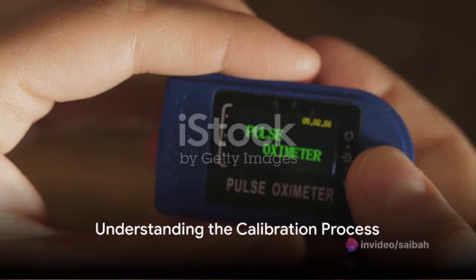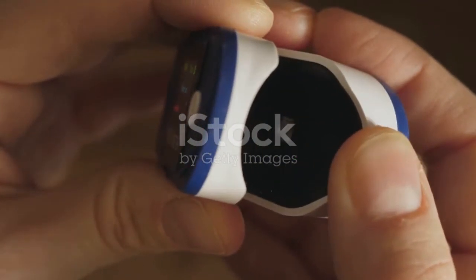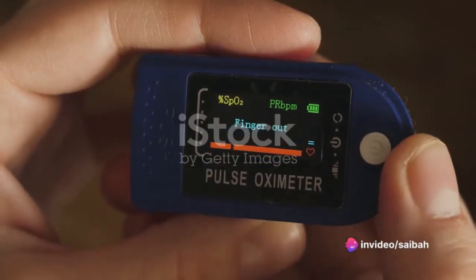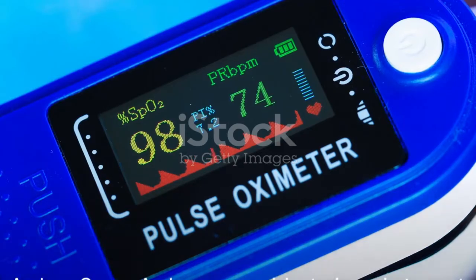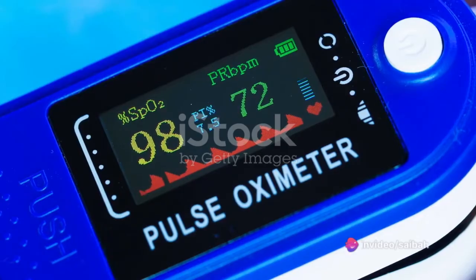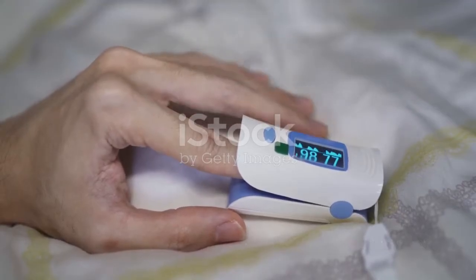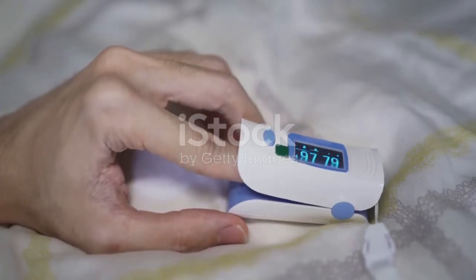Calibration is a critical process that ensures the accuracy of an oxygen analyzer. In the simplest terms, calibration is the process of setting or correcting a measuring device — in this case, an oxygen analyzer. Your oxygen analyzer is like a talented musician: it can hit all the right notes, but to create beautiful music, it needs to be in tune.